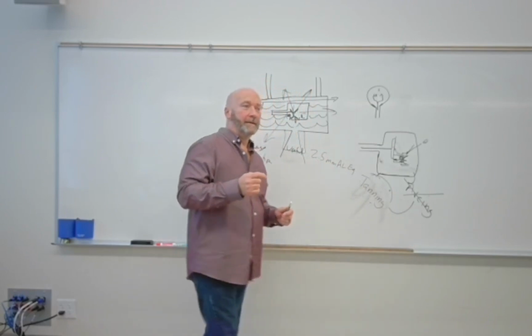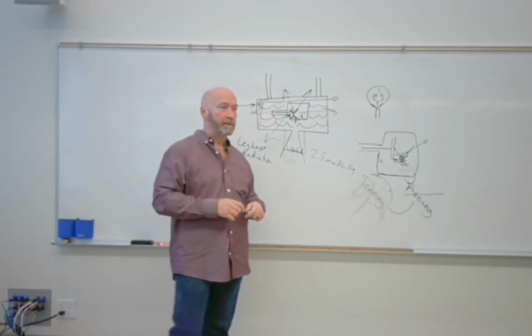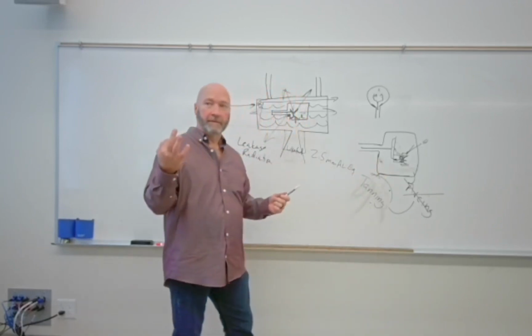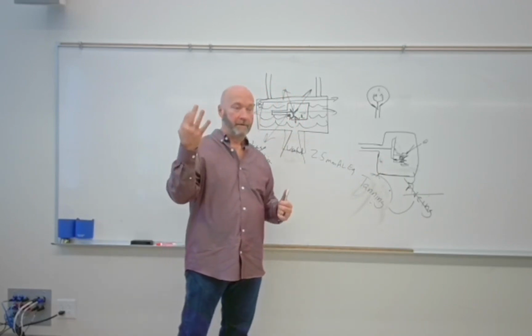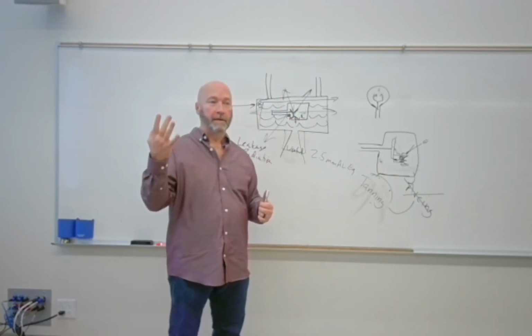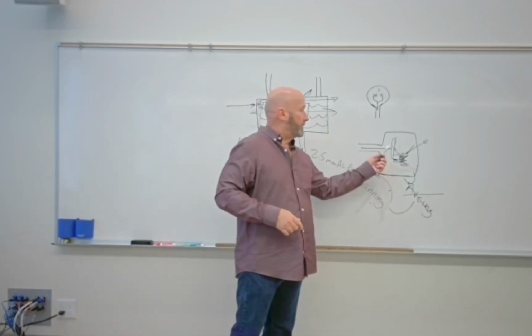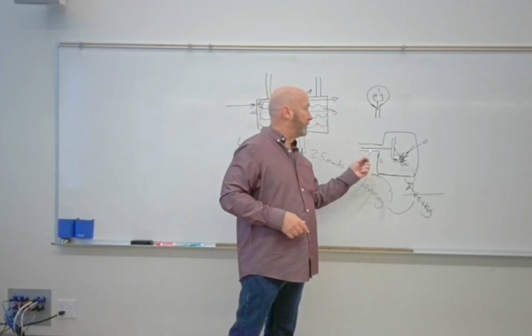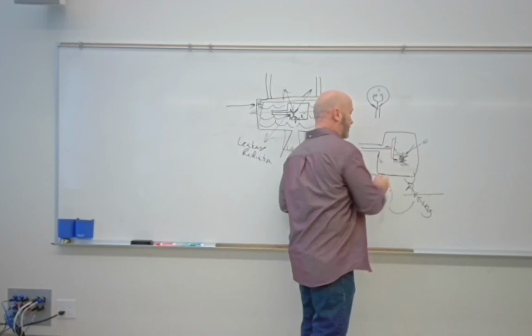Okay. That might have kind of made you mentally slam on the brakes, right? Because what did we want? We wanted 3 different types of heat dispersion. We wanted convection, conduction, thermal radiation. Right, so we got thermal radiation, we got the convection up here, but what we want to do is stop the conduction before it goes down this way.